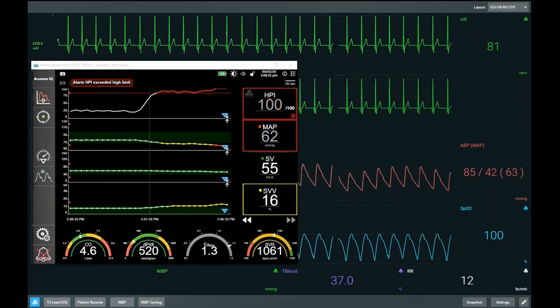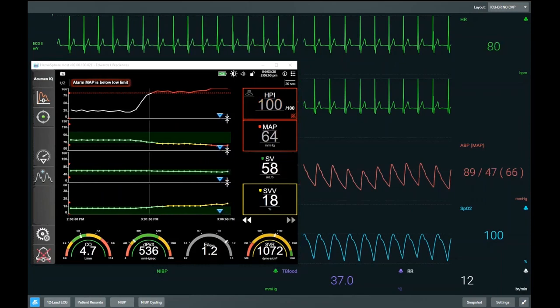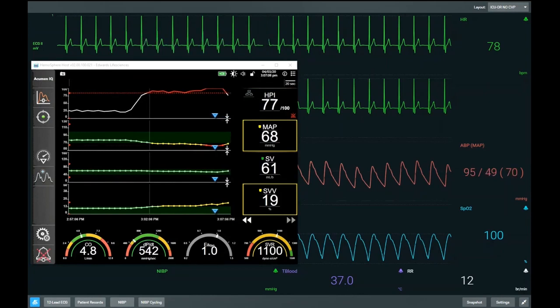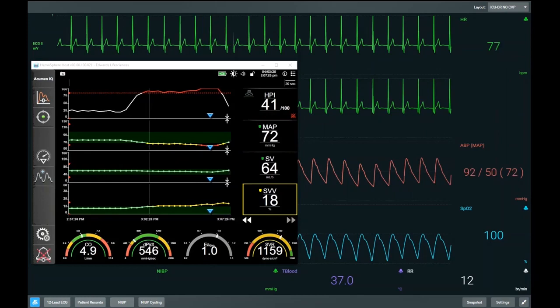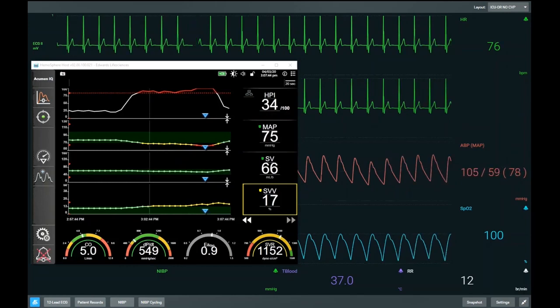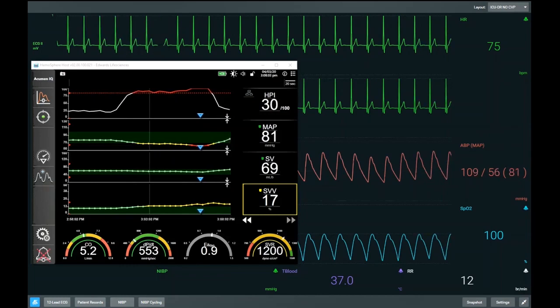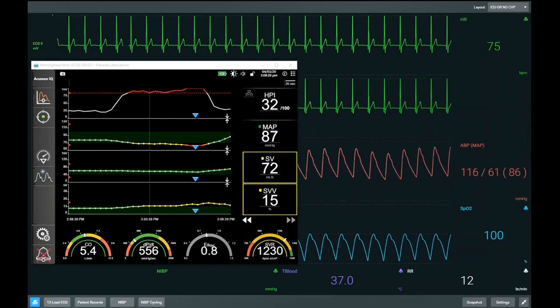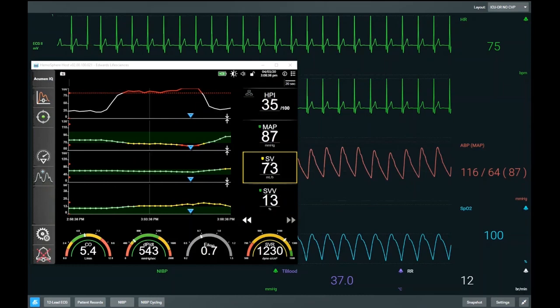We've now given this individual a fluid bolus. If we expect blood pressure to improve, we need to check whether all Eadyne criteria are met. The patient must be a preload responder — SVV is raised, so that's met. They were hypotensive, and Eadyne was greater than 1. Hence, when we give a fluid bolus, we see HPI starts to drop almost instantaneously because we're putting stability back into the system. Our mean arterial pressure has increased from a low of approximately 62–63 mmHg up to 81 mmHg, and we've had a greater than 10% increase in stroke volume. Because Eadyne was raised, that increase in stroke volume has translated into an increase in mean arterial pressure.